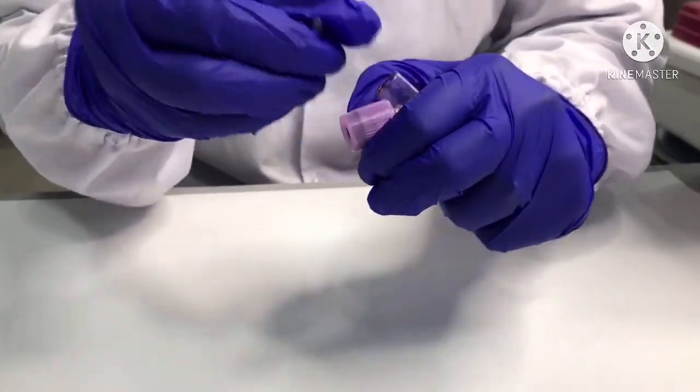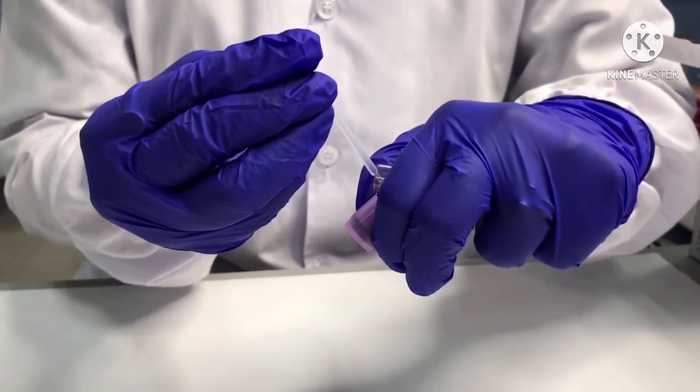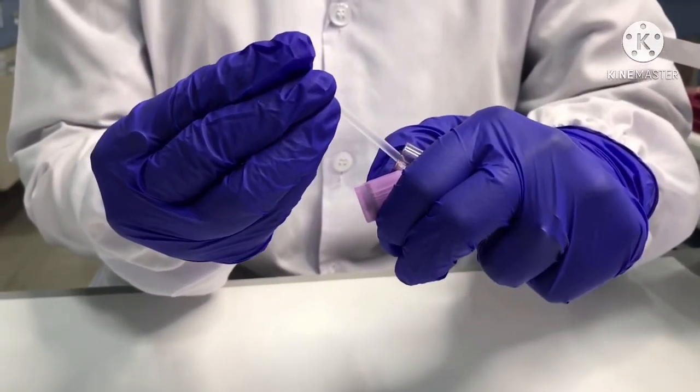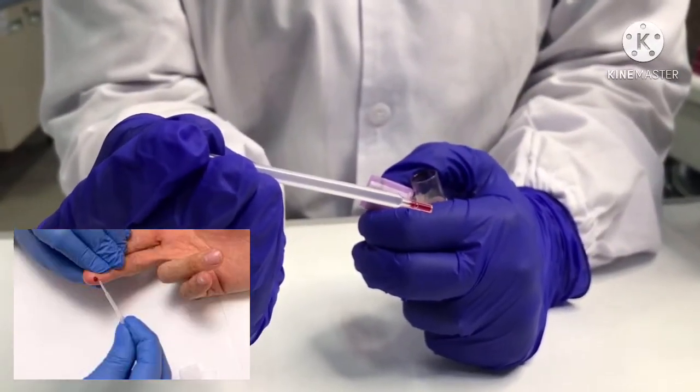Aspirate an 8 microliter blood sample using a disposable plastic pipette and immediately transfer it to the sample window A of the test device. We can also use capillary blood collected from a finger prick.